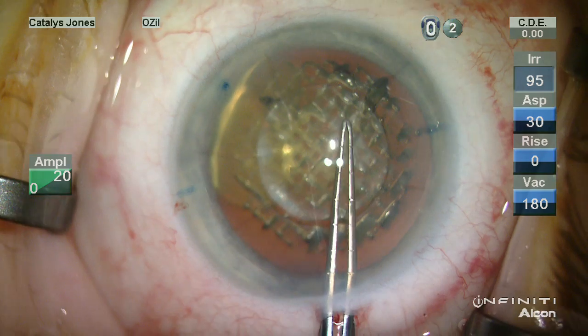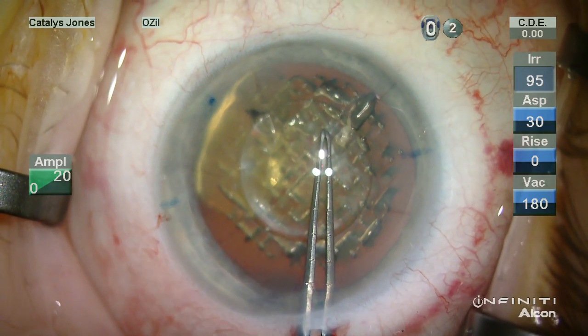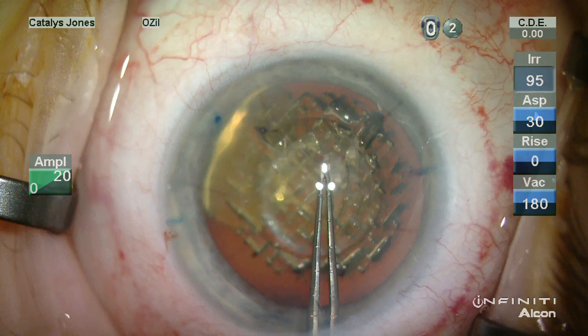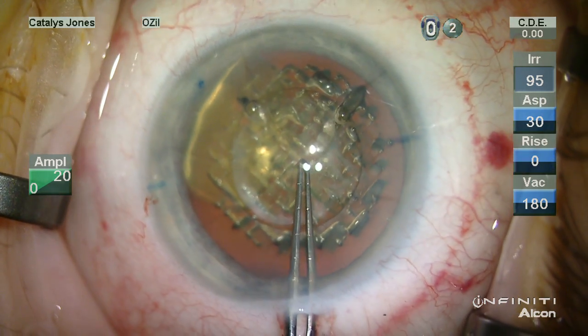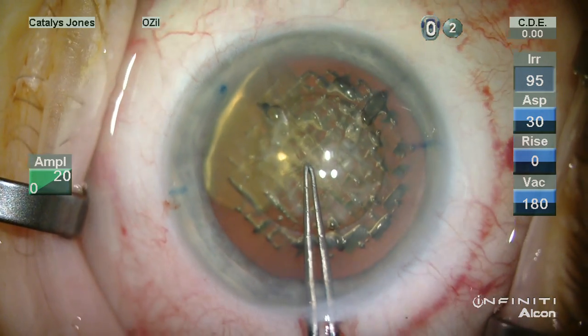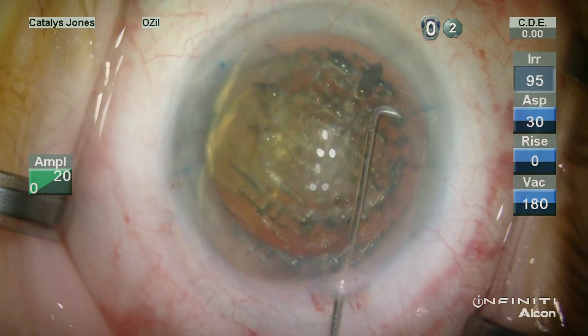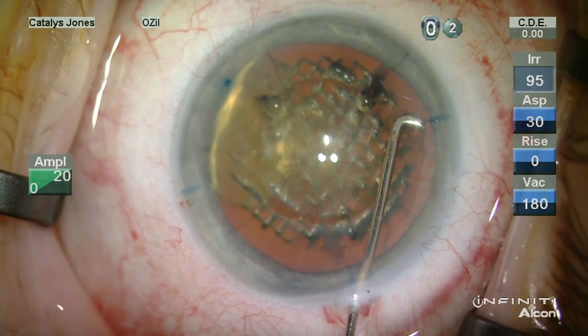I will check the capsulotomy for its completeness, and this is done using a touchdown technique at each of the areas of incisions that overlie the capsulotomy. Once I'm assured that the capsule is completely separated, it is then removed easily.